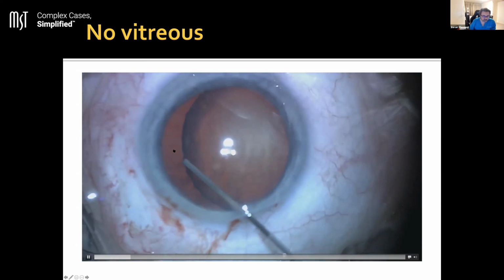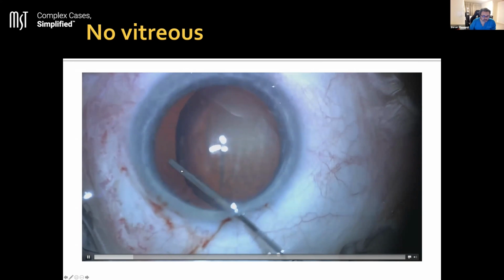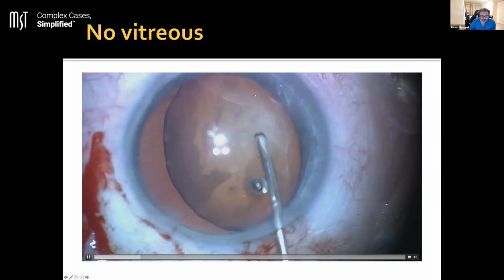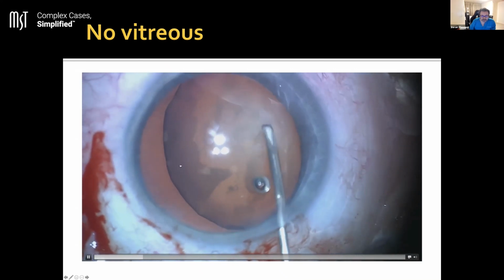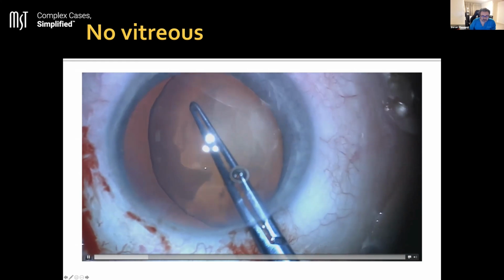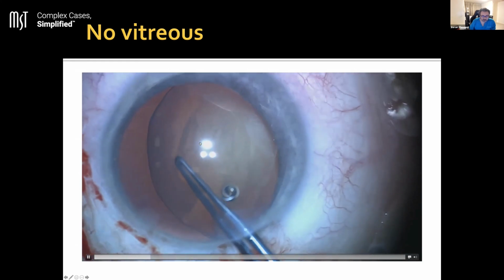So you can see the zonules here, which are stretched. We put some Viscoat over here to tamponade this area, and some cohesive viscoelastic as well. And then you can actually perform a capsulorhexis on this subluxed lens. And again, you've got to center the capsulorhexis here on the lens, not on the pupil, obviously.